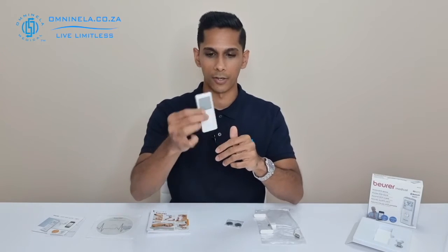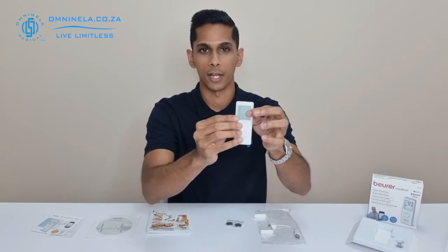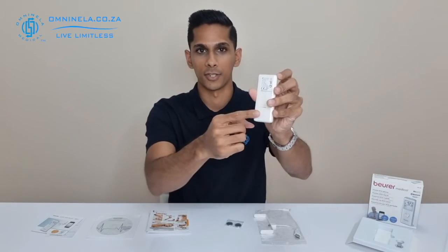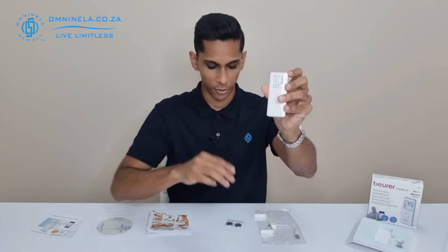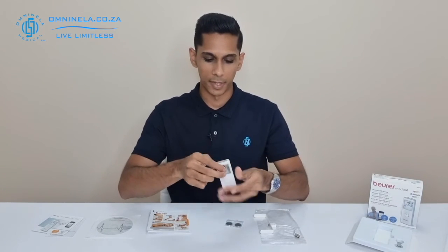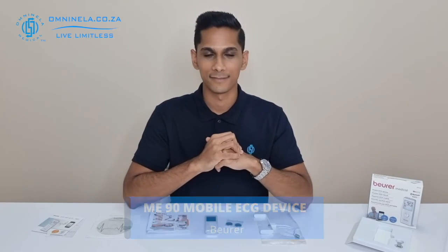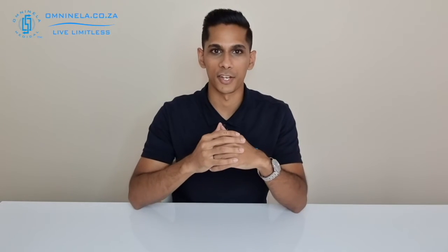Lastly, we've got the device itself. Taking a quick walk around: on the top end we have our electrodes, on the bottom end we have our sensor, on this side you'll have your USB inlet, and on the front side you'll have your screen and your on/off button. On the back you'll have your battery compartment, which is where you insert your batteries.